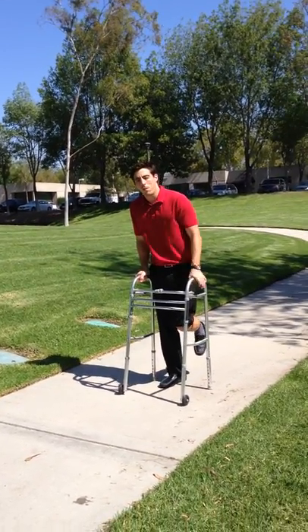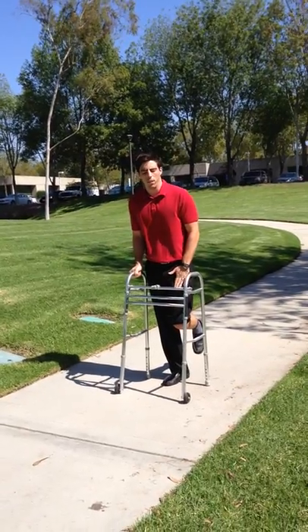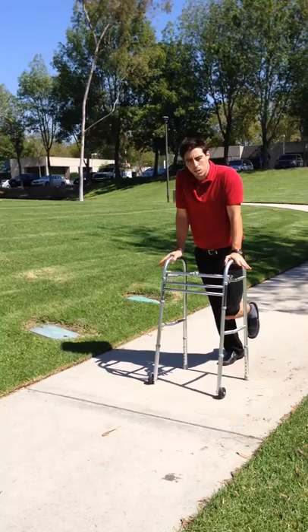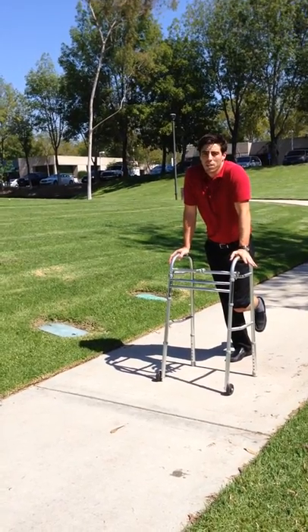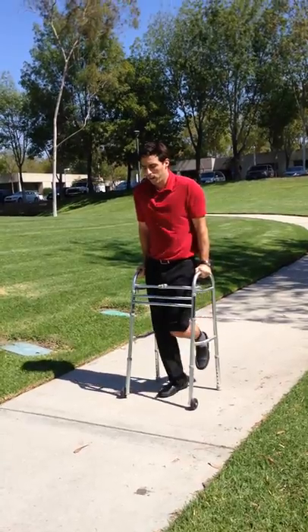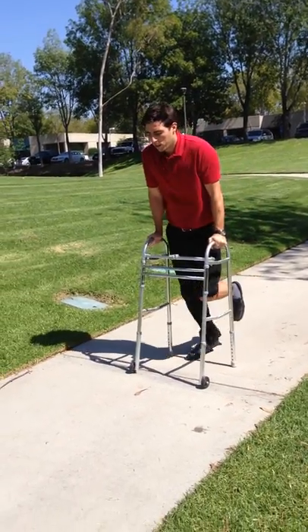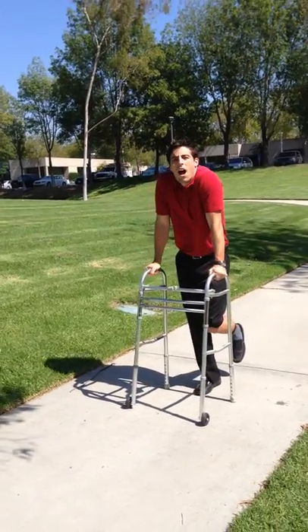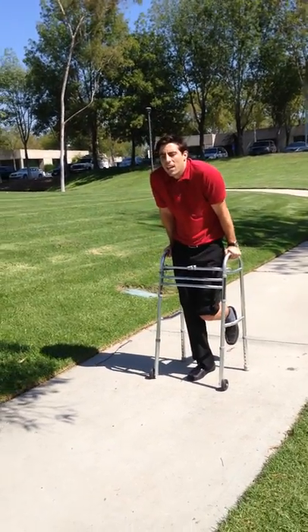My left leg should have no weight bearing through it. First, I'm going to roll the walker forward, lift myself with my two arms while avoiding too much neck stress. Try and use the momentum of your good leg and swing forward — walker, good leg. Notice that I'm not hiking my shoulders, which would lead to neck pain.